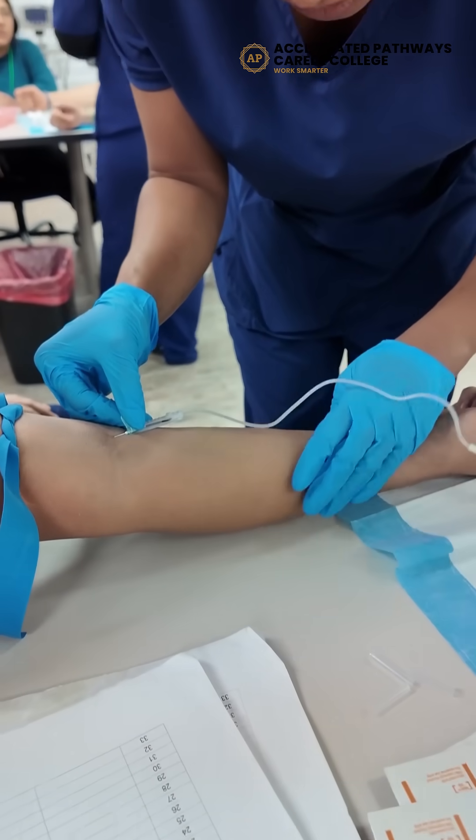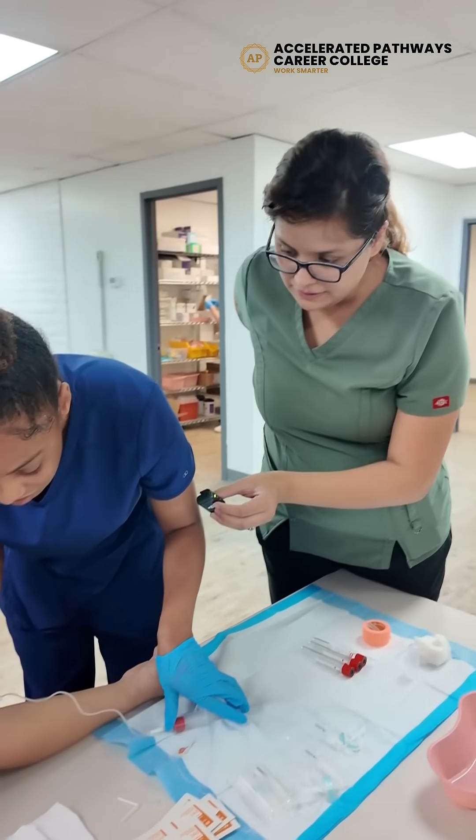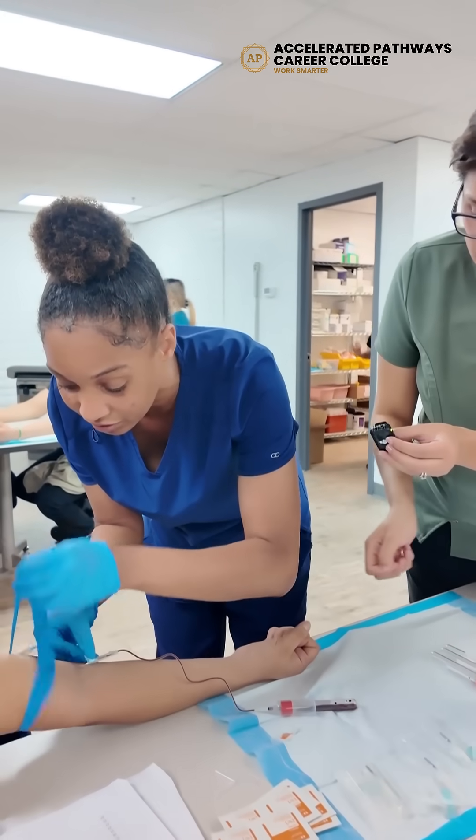Perfect. And then put the vacuum tube in. Okay, you don't want to take a lot of blood out. And turn it off.